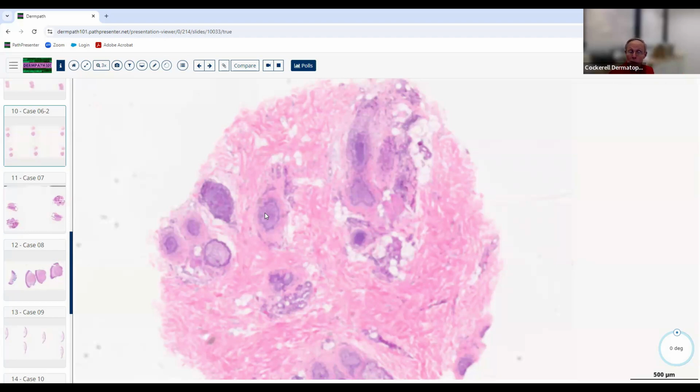So you look for, is the scar just hitting the follicle alone, or is it diffusely involving the dermis? And if it's involving the follicle, where is it in the follicle? Is it at the infundibulum and the isthmus, where we see lichen planus, for example? Is it near the base of the follicle, where we see this onion skin rimming around it, like in chronic traction alopecia, which doesn't just hit only the infundibulum? So there's a pattern to the scarring also that can give you clues to the diagnosis.